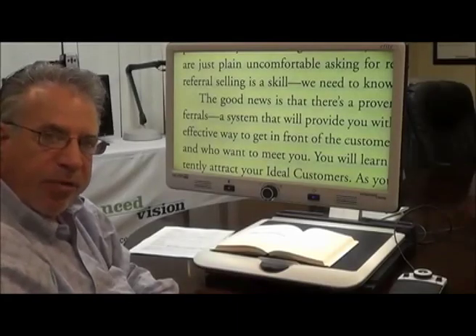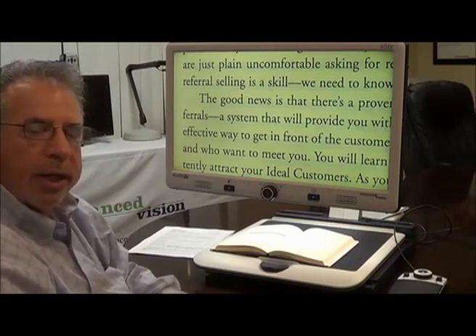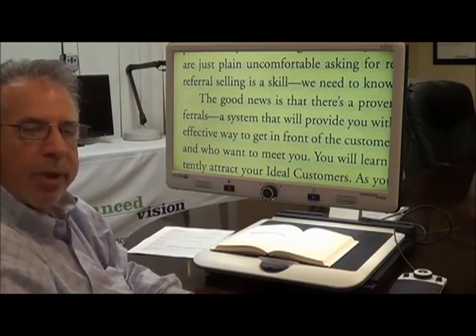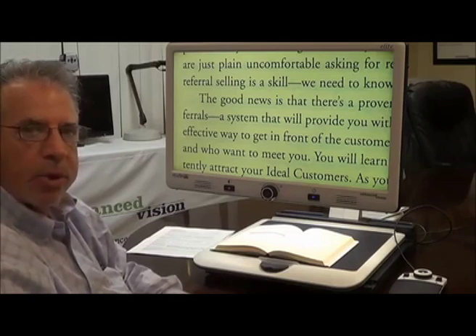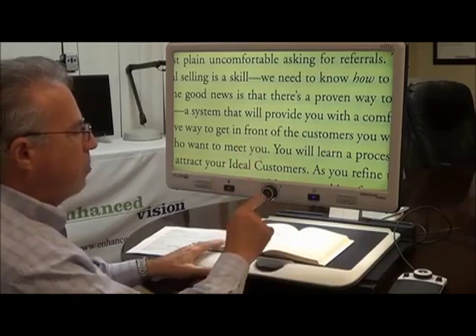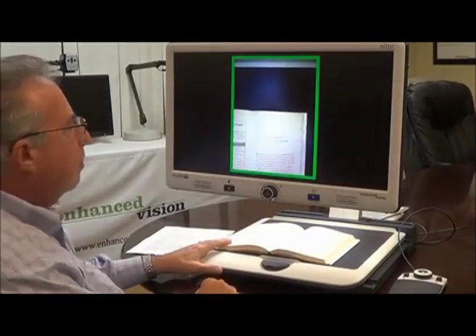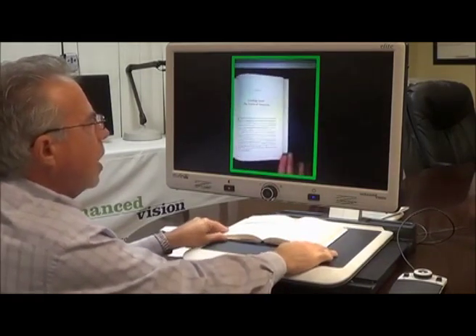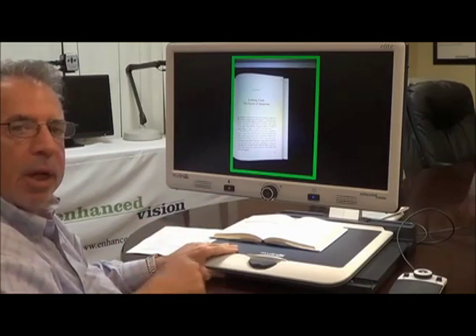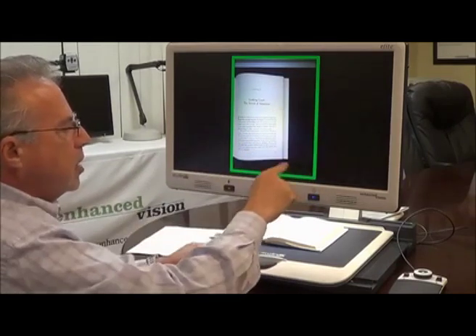One of the really nice features of the Merlin Elite Pro is the ability to do what is called OCR — optical character recognition and text-to-speech. I can take any document, book, magazine, anything I wish to look at, and place it on the XY table. Now I'm in live mode, and by pressing a single button I switch to OCR mode. The device prompts me to align my document inside the frame, which you can see here — in this case it's green.